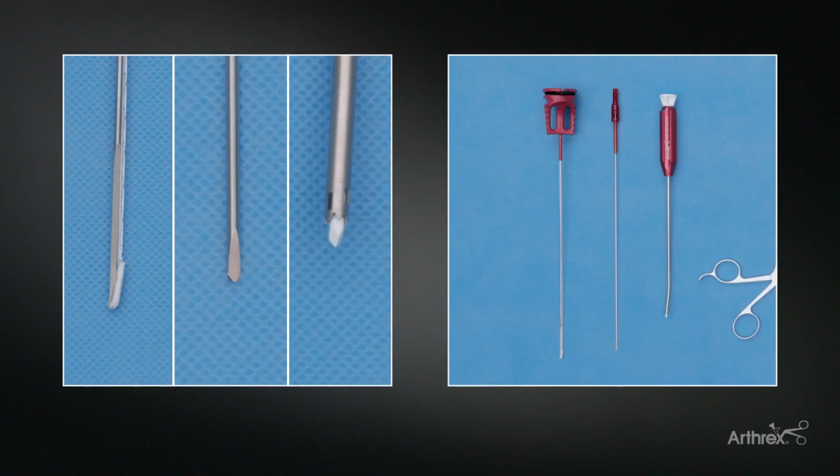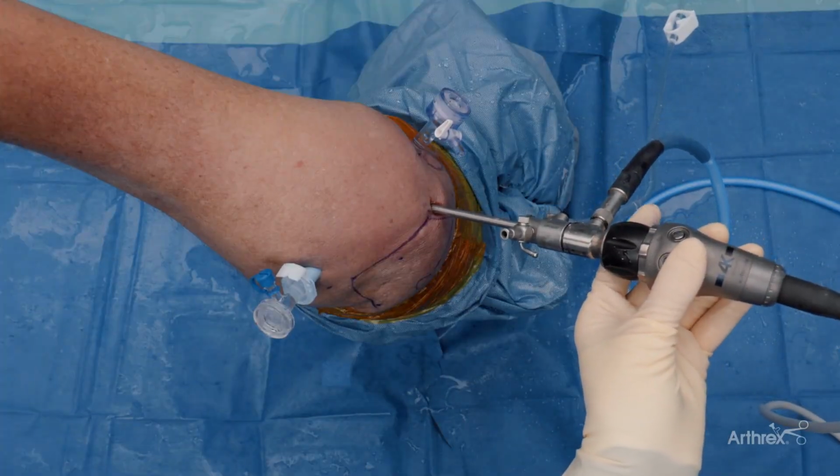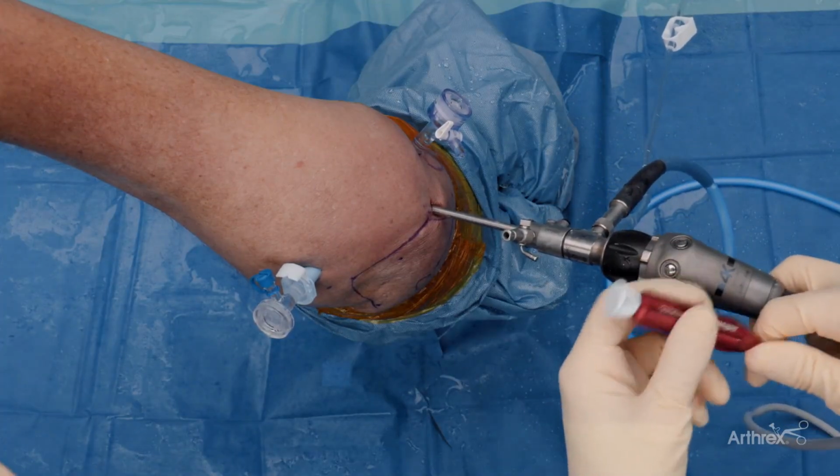So today we're going to be doing an arthroscopic posterior labral repair, and for our fixation, we're going to be using knotless FiberTaks with the curved guide. We're going to start with the most inferior aspect first. And so we start with the curved guide.